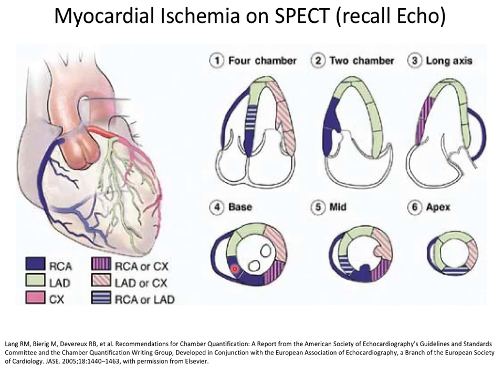Whereas if these vessels, the RCA and the circ, are open, you'd expect that to be bright. And so that's just keeping in mind for our task that we're trying to achieve here, spatial resolution may not be the ultimate imaging criteria that we want to maximize, because basically we just need to find out if perfusion beds are being perfused.